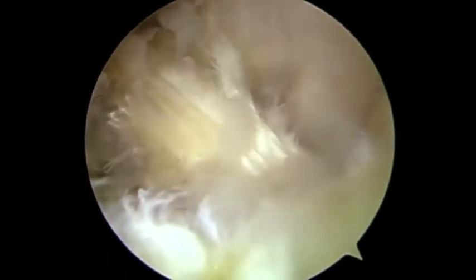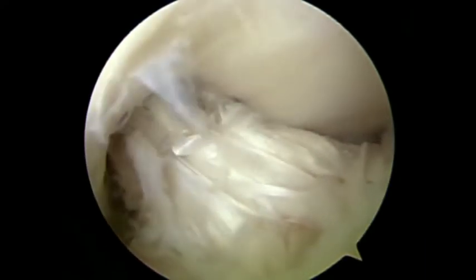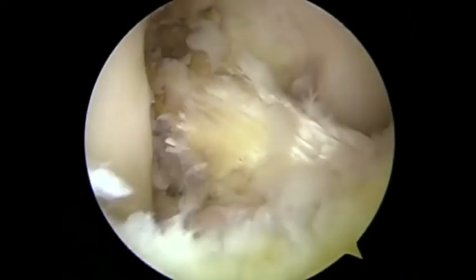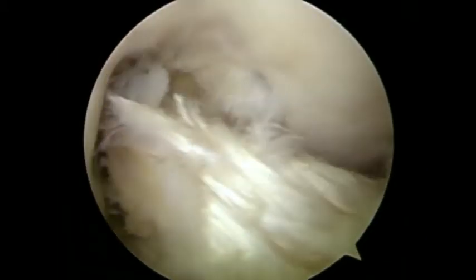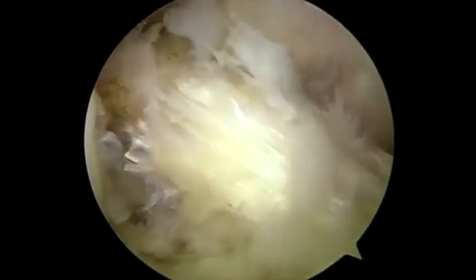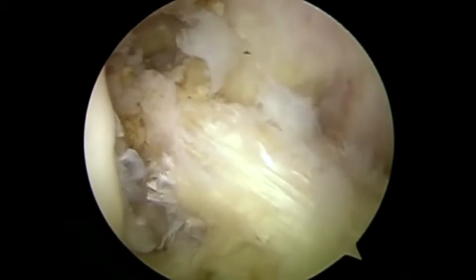During the course of the radiofrequency ablation, we should also carry out periodic assessment of the integrity of the ligament and the adequacy of debulking of the anterior cruciate ligament. Here we see the leg being taken through a range of motion to ensure that as the leg comes into extension, impingement is improved.